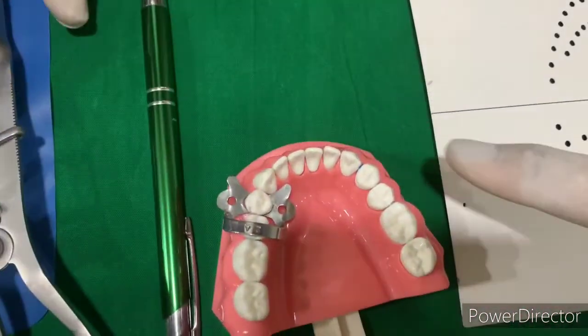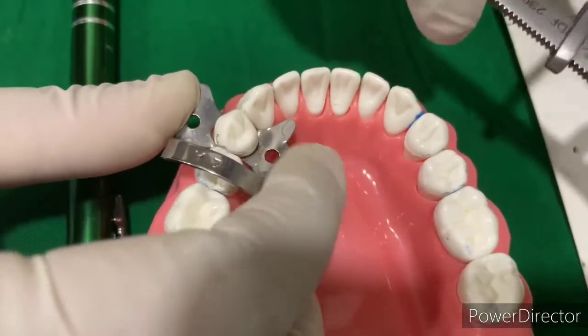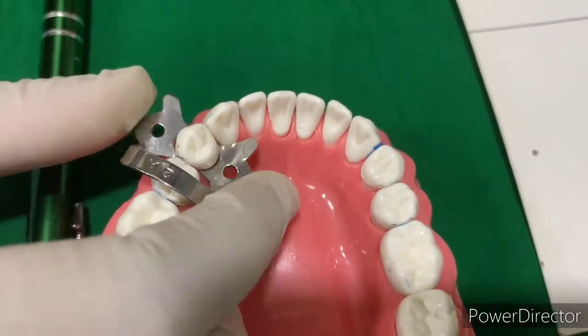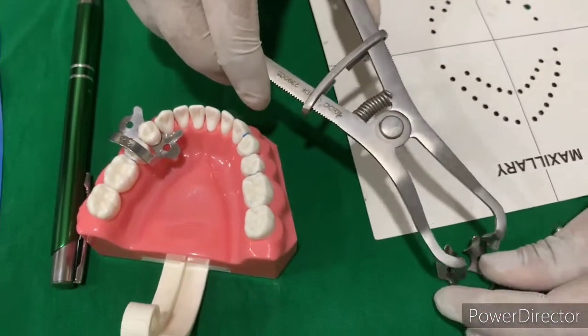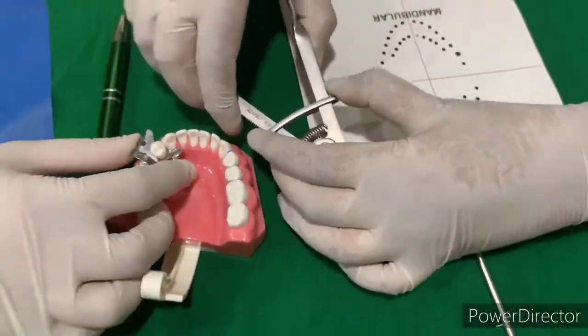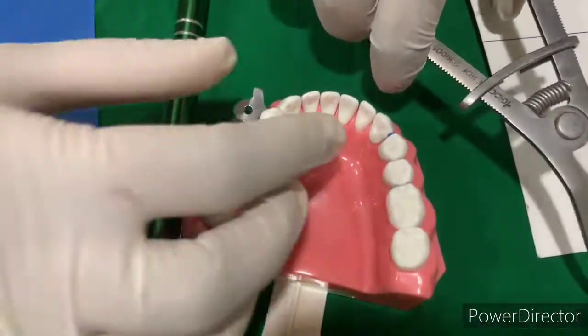We'll place the clamp on the premolar. This clamp is suitable for this tooth. It should not be rocking. It should be stable after the selection.